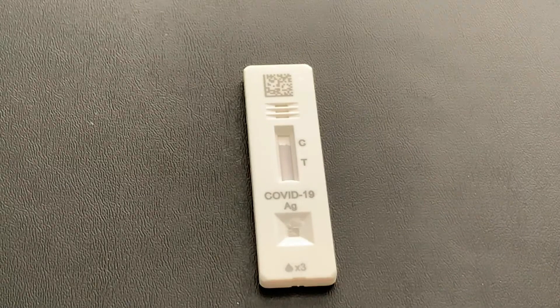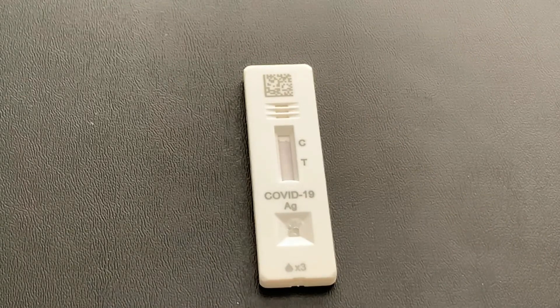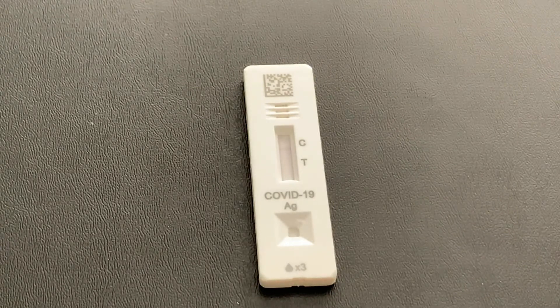Once you're done with that, set a timer for 10 minutes. Make sure you don't look at the results until at least 10 minutes, although the instructions say do not read after 15 minutes. So your most accurate test result is going to come at that 10-minute mark.